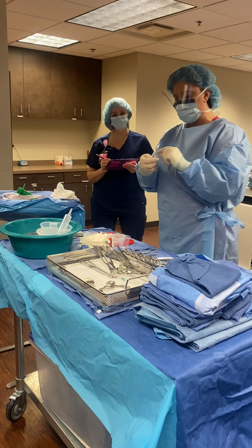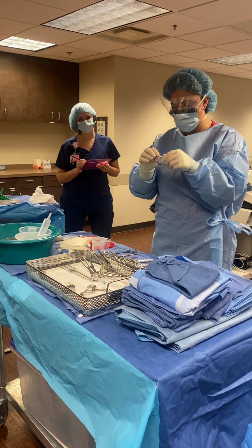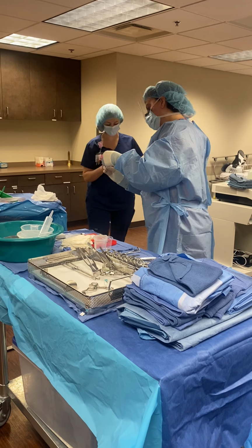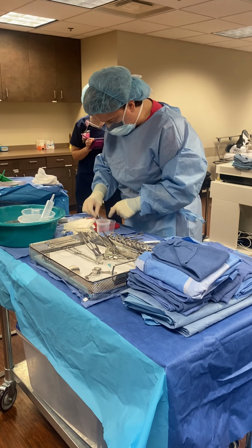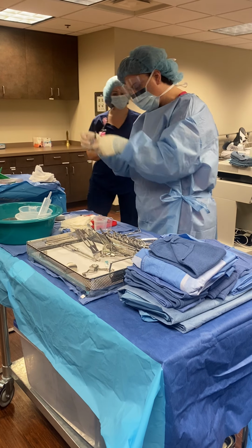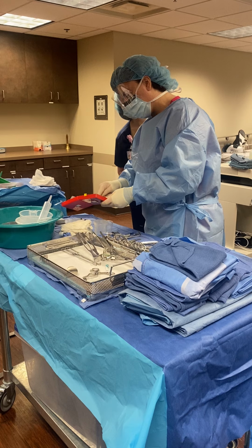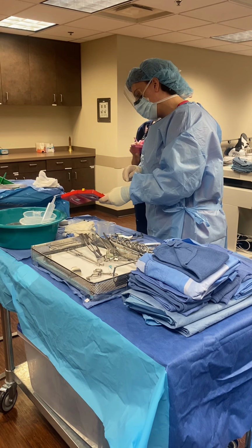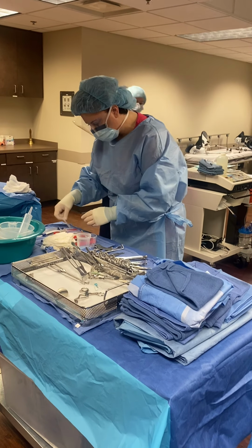And then when you have packages like this, you just want to visualize the needle. It's kind of like OCD kicking in, but see that number three. Okay. Three there. Blades. One, two, and then take a peek in here. Three, four. Four blades. And then hypos, one, two. Two hypos. Okay. I think that's everything, huh?